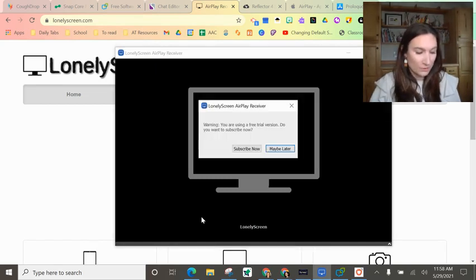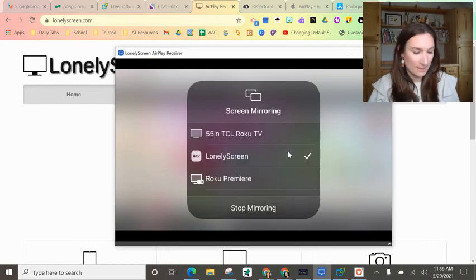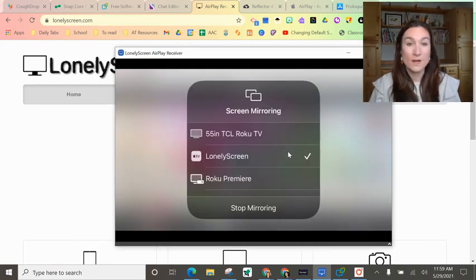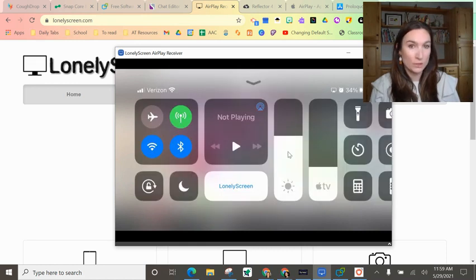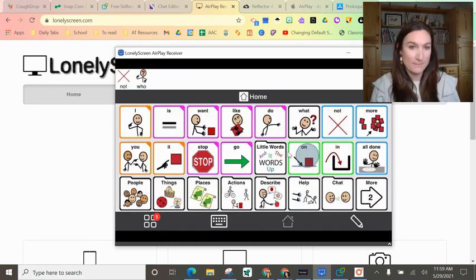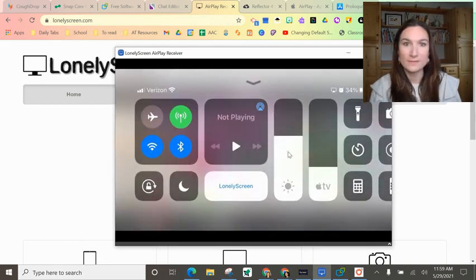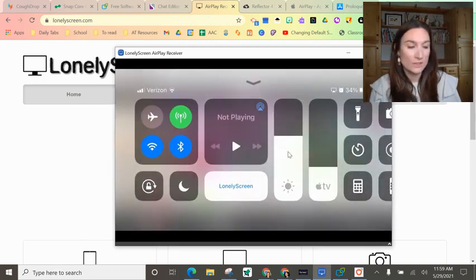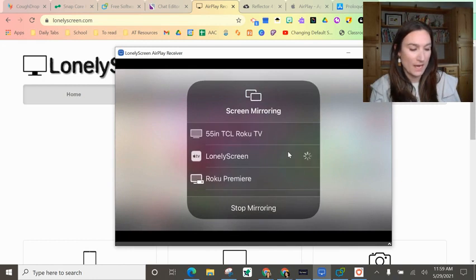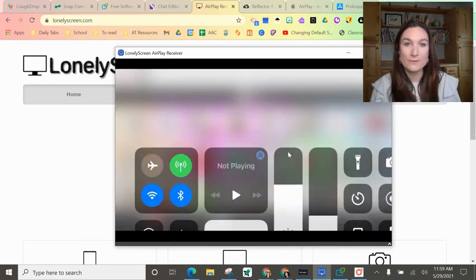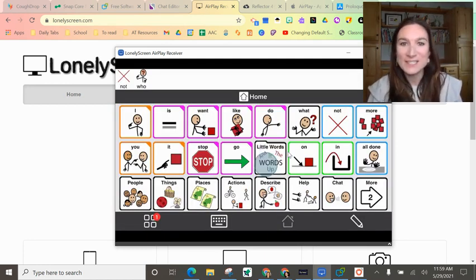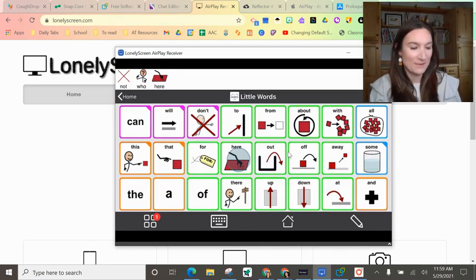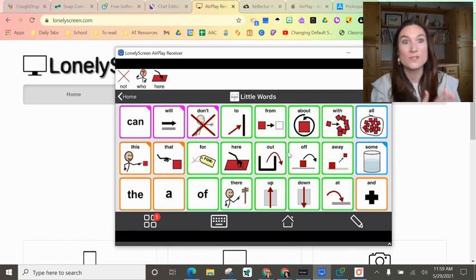See, there we go. I just say maybe later. Okay, so this is what will pop up and I select Lonely Screen. I just swipe up on my iPad - you can see I have my little assistive touch there. I swipe up and then when I go to mirroring, I choose the option of Lonely Screen. I can swipe down and then there's my system, and I can provide modeling like that.